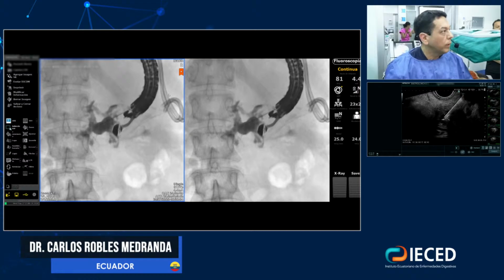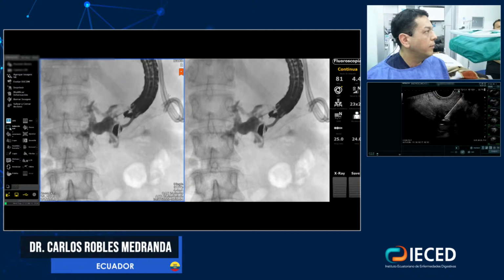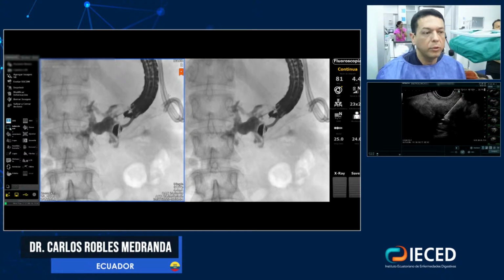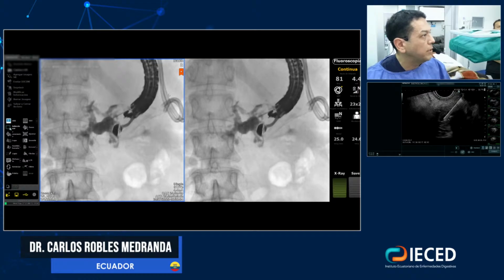So what I did was completely quick and faster because the main pancreatic duct was very dilated. And in those cases, I believe it's much better to make a pancreatography, right? Using US. It's quickly, faster, and I will diminish the risk of the patient. Give me more contrast.